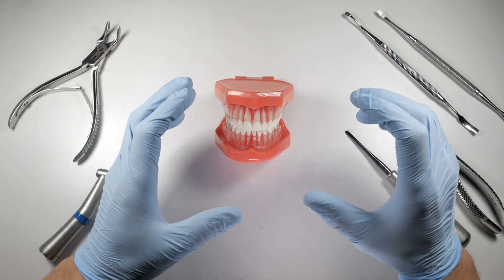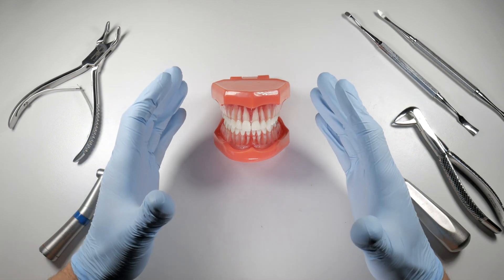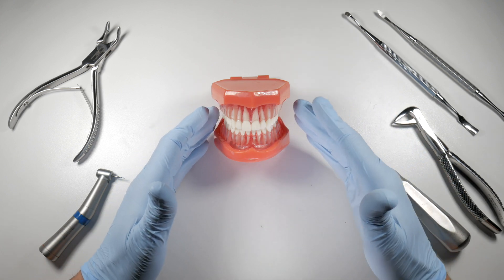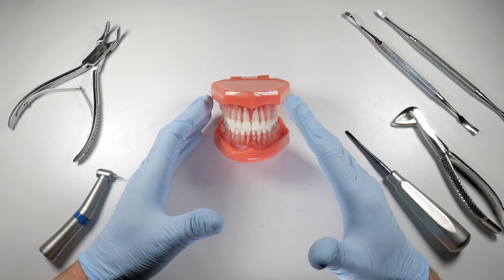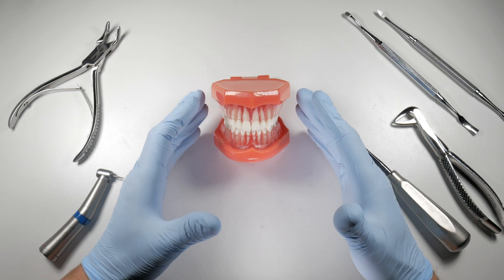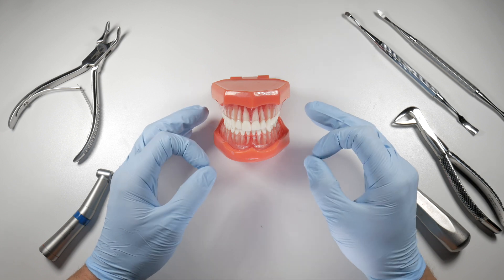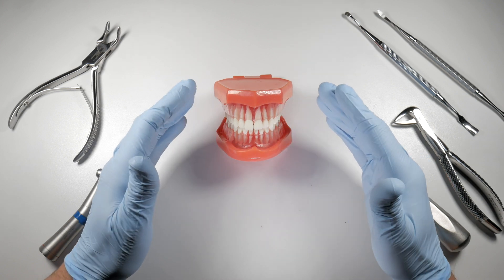When you're delivering a tooth and you hear that crunch, that's the buccal plate breaking. Now you need to make an assessment: is the bone still attached to the tooth, still attached to the gingiva, or both? If it's still attached to the gingiva or periosteum, you can usually leave it there, assuming you can separate it from the tooth fragment. If the bone is loose from the gingiva, you're not in a good situation — you'll have to remove it, because without the periosteum the blood supply is so poor the bone will die and be rejected by the body.